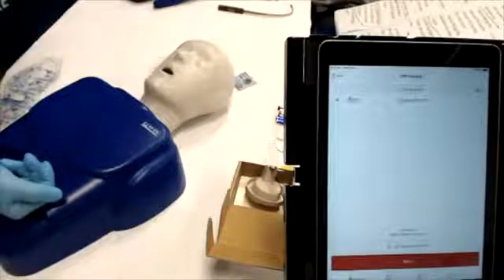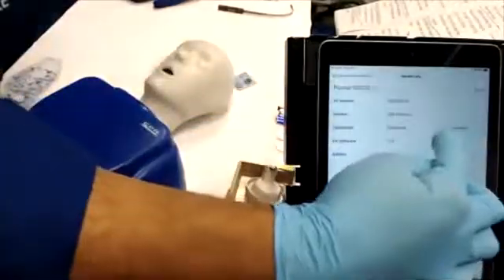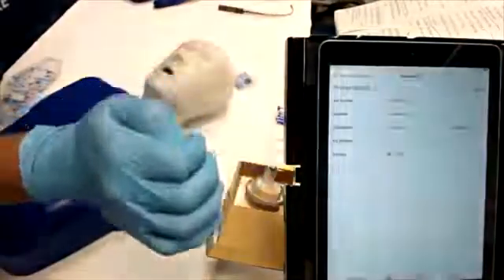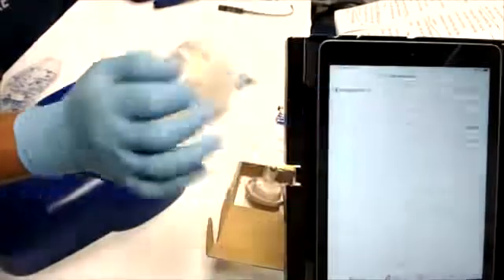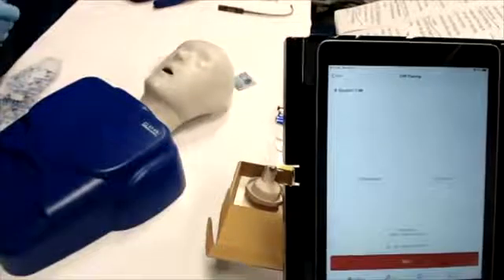Initial mannequin setup will require breath calibration. Users should follow the on-screen prompts for this step. The breath calibration is critical for accurate ventilation feedback for both adult and infant mannequins.